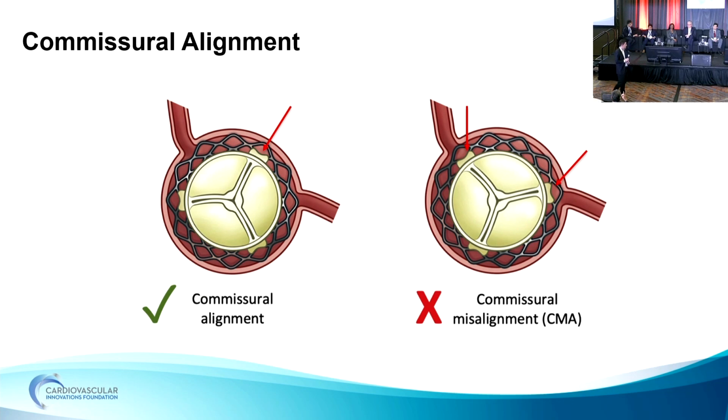And I assume you gave heparin and everything? Yeah, so ACTs are more than 250. We check them before we even introduce the valve, so we're pretty confident that everything is looking good. Just a question: did you pre-BAV this? No, we did not pre-BAV.